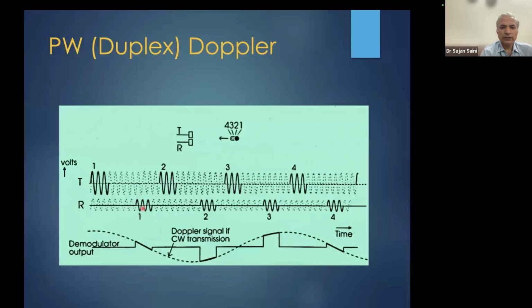So now the machine knows that my beam was originally like that, and that it overlaps with this, and once it overlaps, it calculates some Doppler shift, and then it extrapolates the rest of the Doppler shift. So one Doppler shift is calculated, another overlap, another shift is calculated, and then it completes the hidden or uncalculated areas, and then makes a maximum.